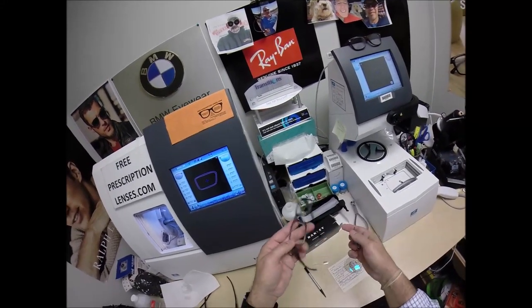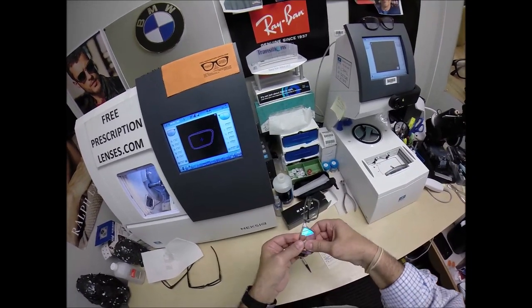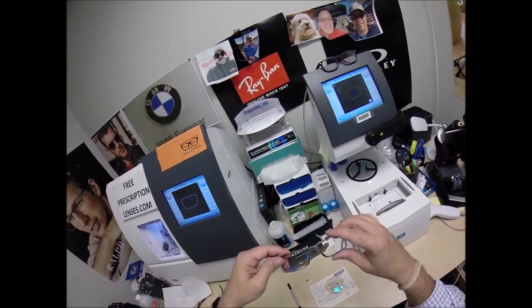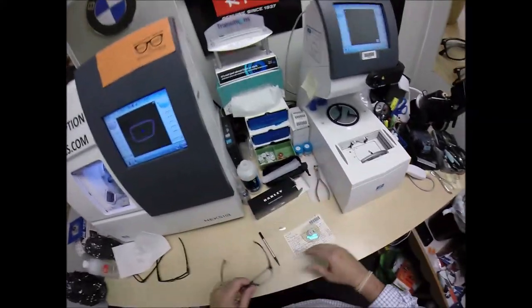To put it back in, again, I rotate the frame around so the temple tips are pointed towards the floor. Tuck it in at the outside corner first. The reason why I push at the nose, the thickest part of the frame is right there. Some people like to put it in here and push there, which you could. I just always like to push down at the nose.